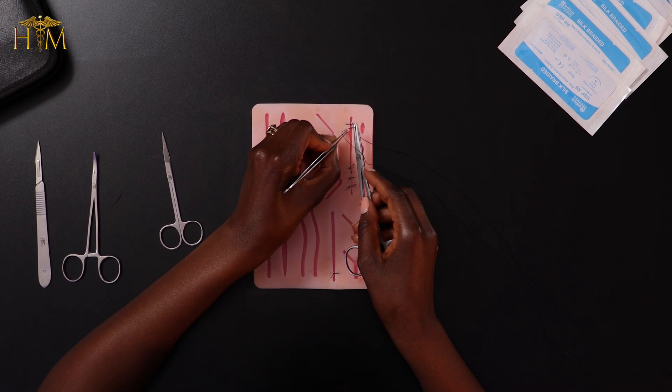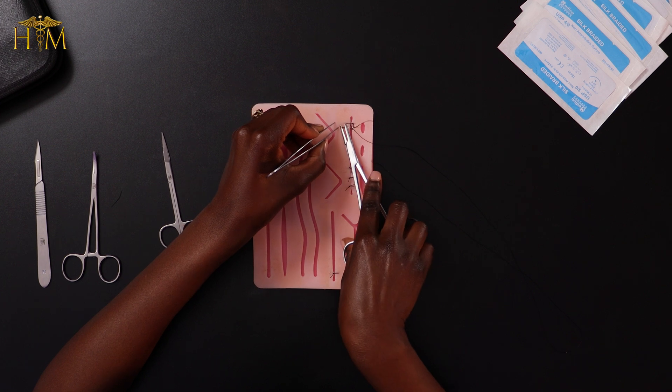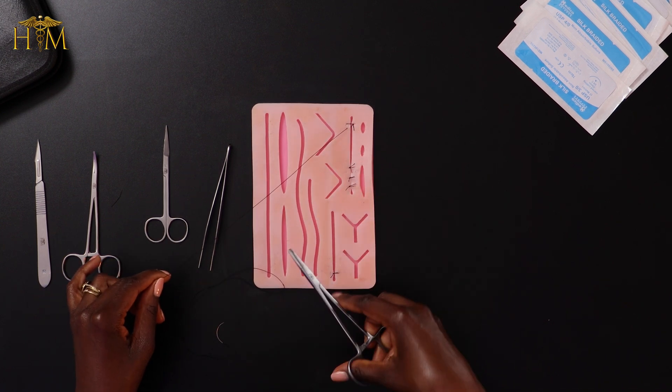I need to reposition my needle on the needle holder. The suture's long, so I just want to make sure I don't put any knots in it. Lock my needle in place. And then what we're going to do is put the needle just under the skin on the opposite side and come out. Again, put down my needle and pull the suture — it's much safer than pulling it with the needle in your hand. Now I've got my suture just perfectly on the other side of the wound. Reposition my needle. And now this is what we call the running bit, because the suture is just going to run through the wound and bring it together.